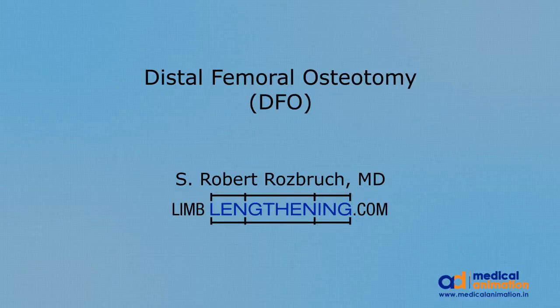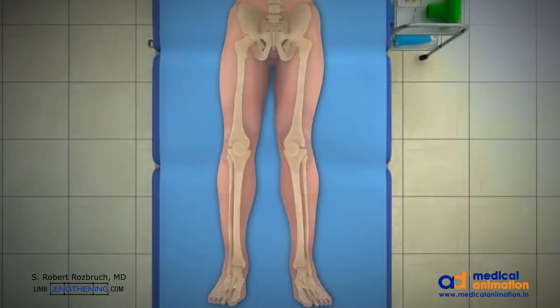This is Dr. Rob Rosbrook doing an animation of distal femoral osteotomy. This patient has a valgus or knock-knee deformity and mechanical axis planning shows there is 12 degrees of deformity.